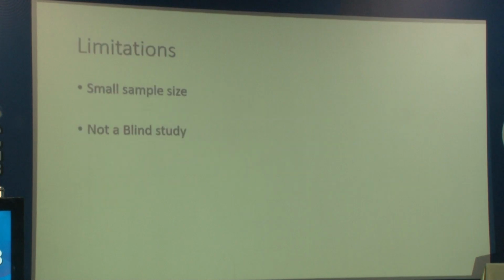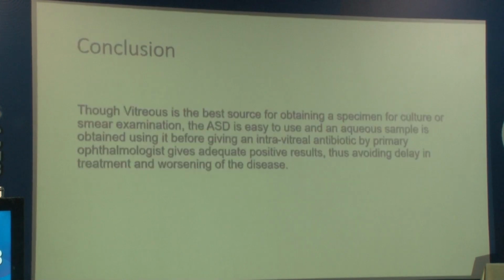The limitations of the study are that it's a very small sample size and it's not a blind study. Though it was a controlled study, it's not blind because the lab technician was there to collect the sample inside the operation theater.